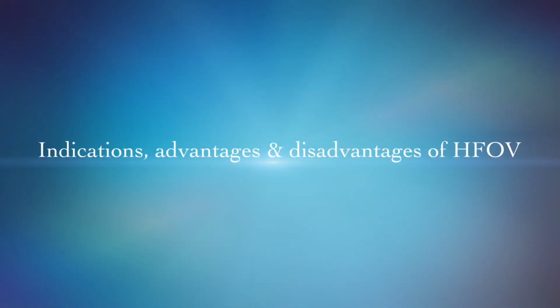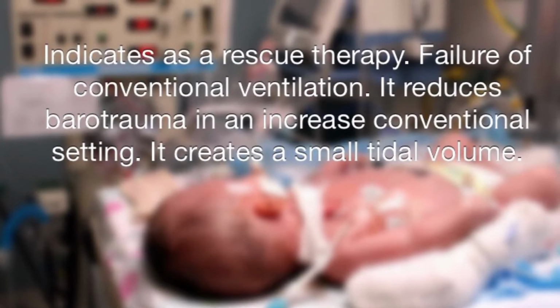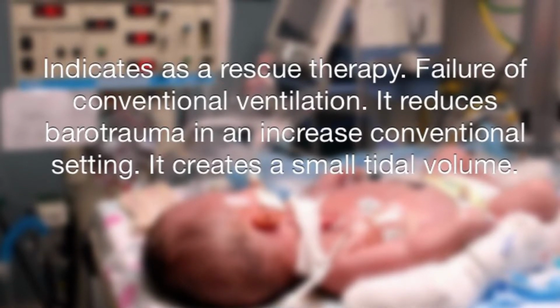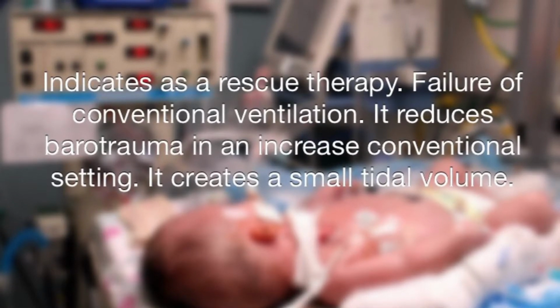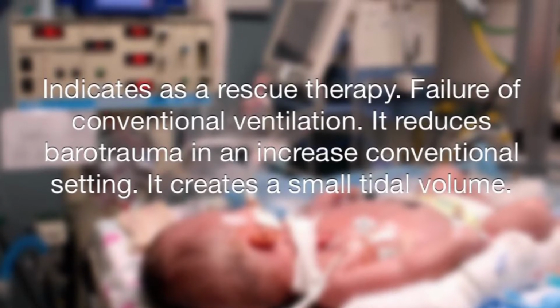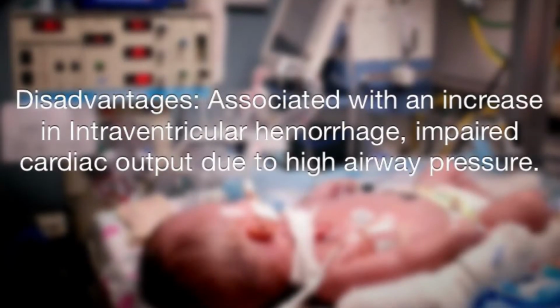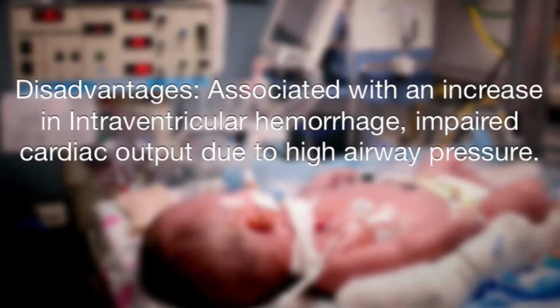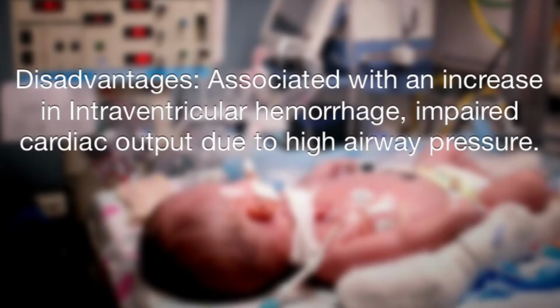Indications and disadvantages of high frequency. It is indicated as a rescue therapy. It is used if conventional ventilation fails. It reduces barotrauma compared with increased conventional settings. It creates a small tidal volume. Disadvantages are an associated increase in intraventricular hemorrhage and impaired cardiac output due to high airway pressure.